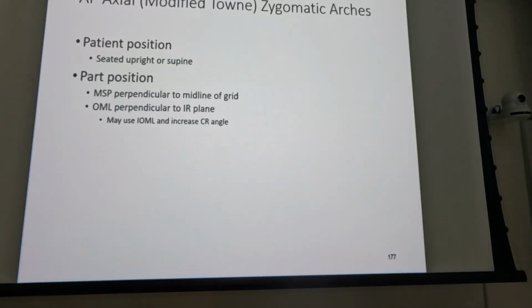All right, so the Towns, you can also diagnose zygomatic arch fractures. So again, the Towns, what did we do with the Towns?